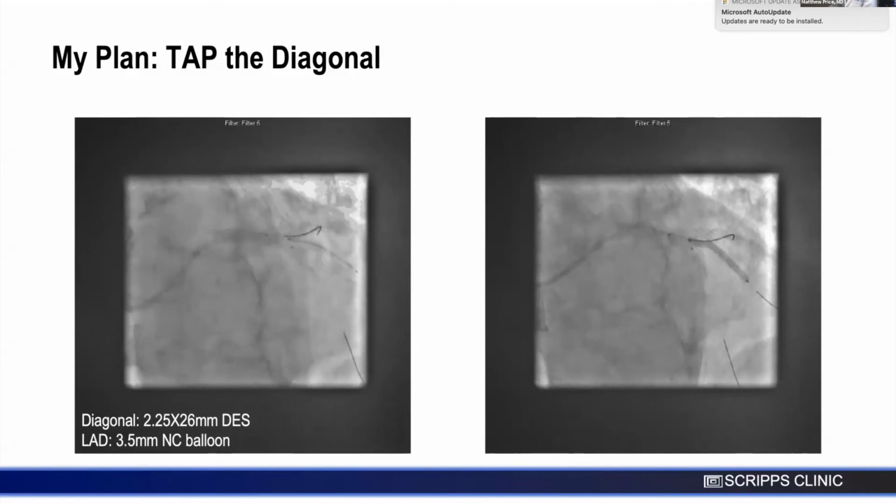And here, to address the question earlier for crushes, how far back do you bring your stent into the main vessel? Somewhat similar, I think, to the TAP. You want it really as minimal as possible, but you don't want to miss it. You still want to be in the vessel itself. So here I did many different angles. I did an LAO, probably this is a little bit LAO-ish, really to make sure I'm just barely in the LAD itself.